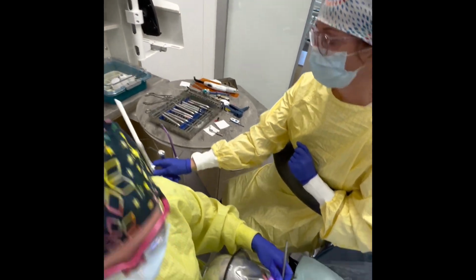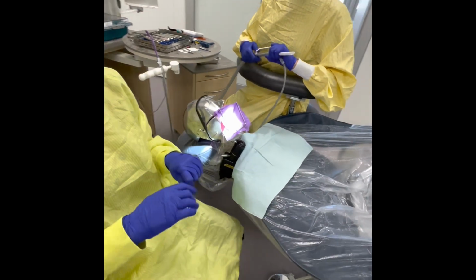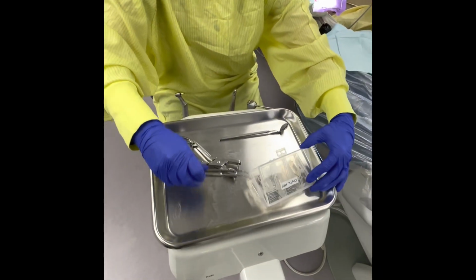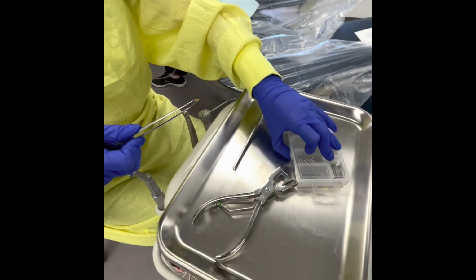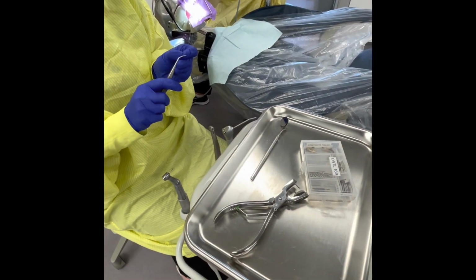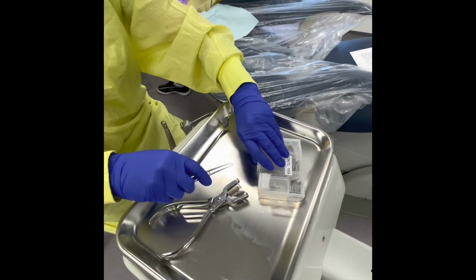Okay, so the next thing that we're going to do, the filling has been completed. I'm going to smooth the lingual of the restoration. So your operator will go into their burrs and take out a polishing high-speed burr. They're going to get another one when they drop the first one.